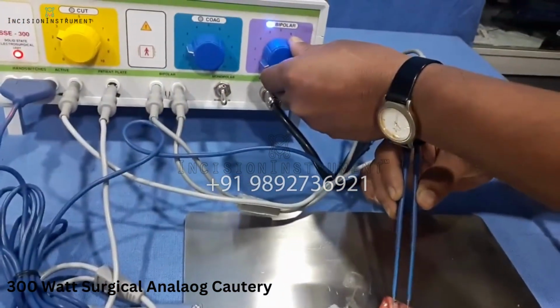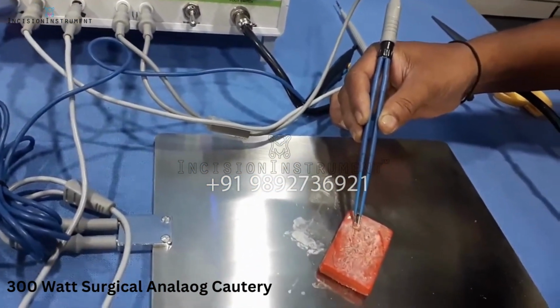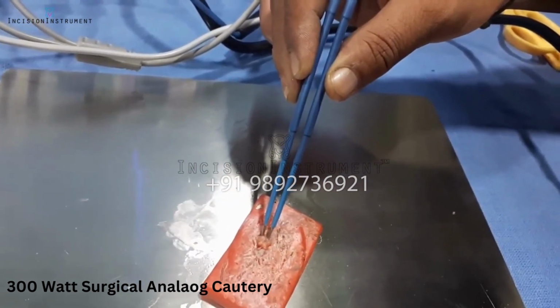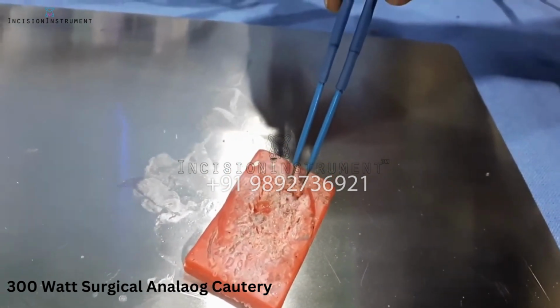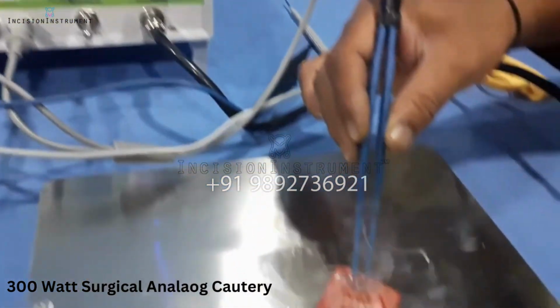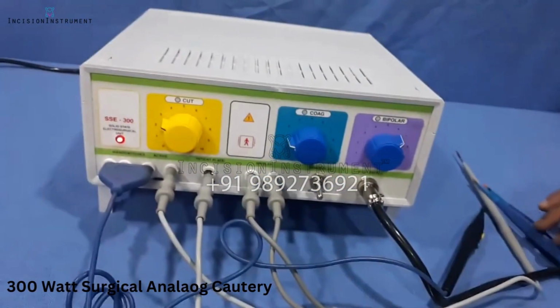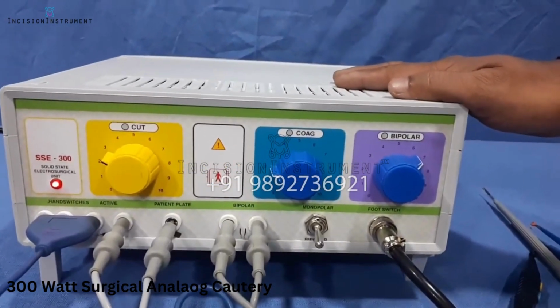Machine was at 0. We are increasing the output. This is how you can use the bipolar mode. This is the 300 watt analog model.